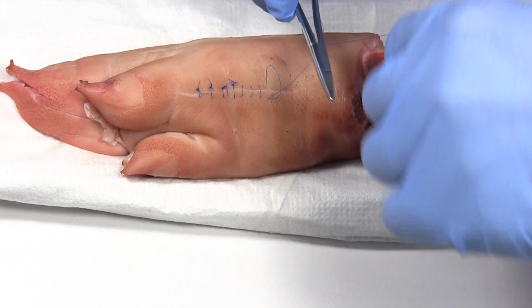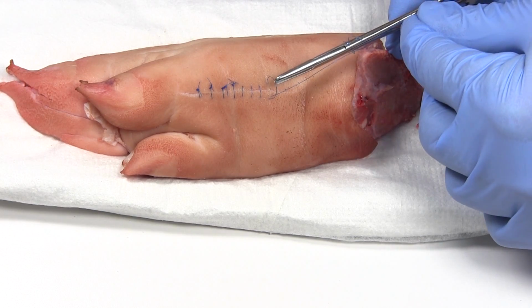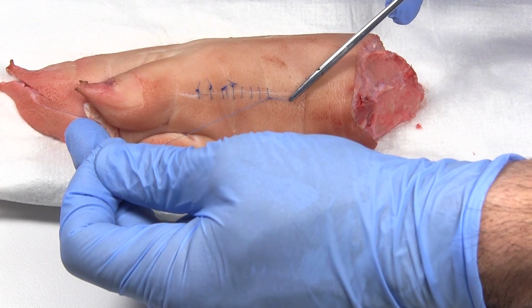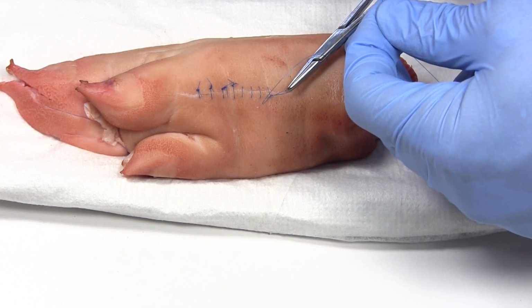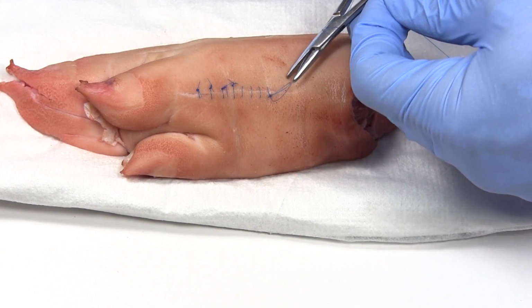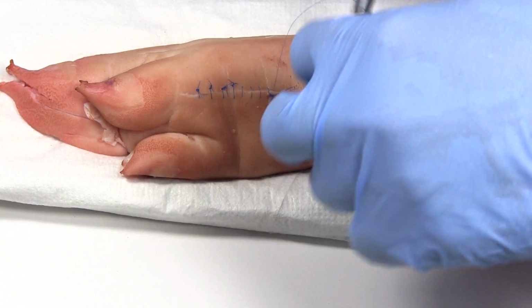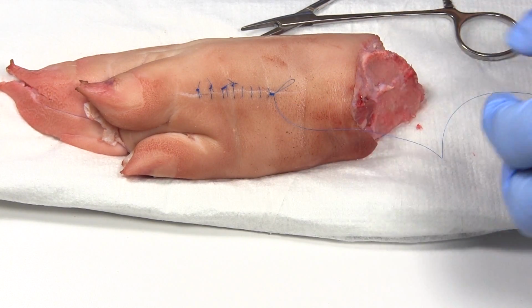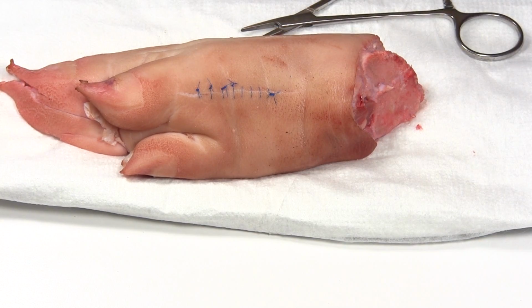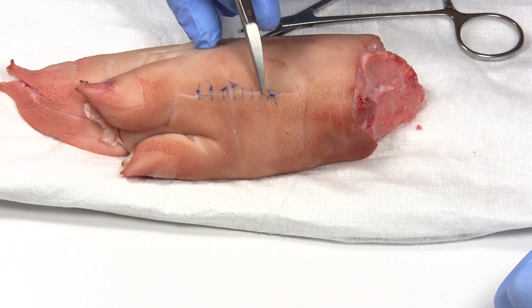So two throws, one, two, and you just grab right in the middle of that loop and then you tie the knot exactly like you would the other way. Tighten it down, and then several more single throws. Four or five times. And you just cut the edges off. And all done. So the knots will be on opposite sides. On this side, down here, it's on this side.